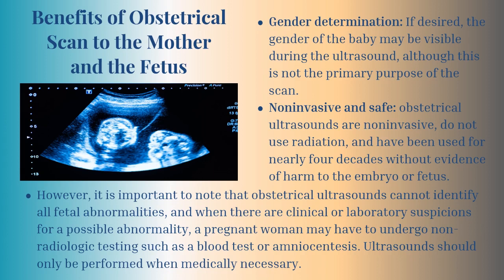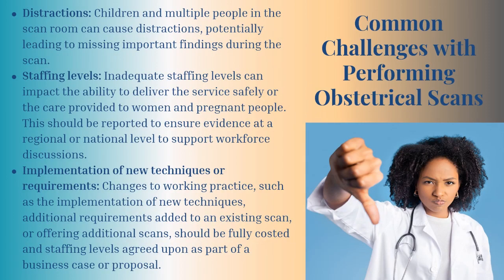However, it's important to note that obstetrical ultrasound cannot identify all fetal abnormalities, and when there are clinical or laboratory suspicions for a possible abnormality, a pregnant woman may have to undergo non-radiologic testing such as blood testing or amniocentesis. Ultrasounds should be performed when medically necessary. So, common challenges when performing obstetrical scans.